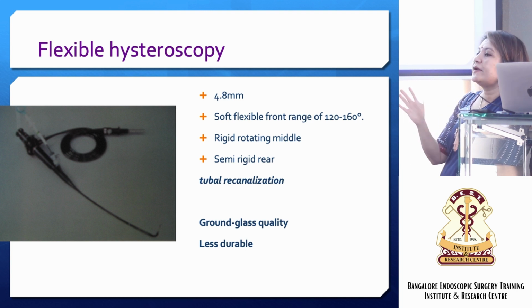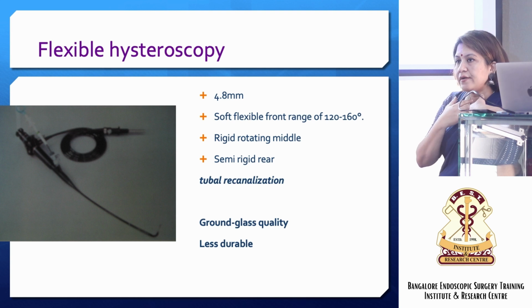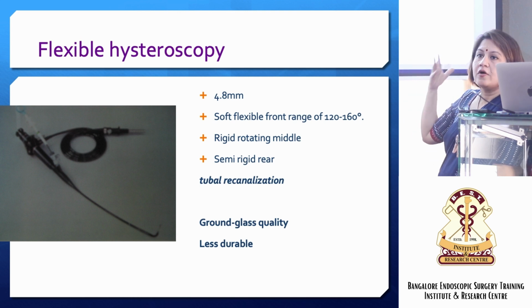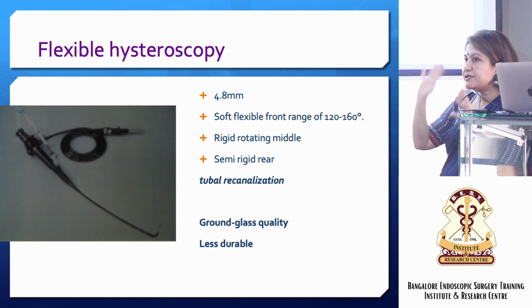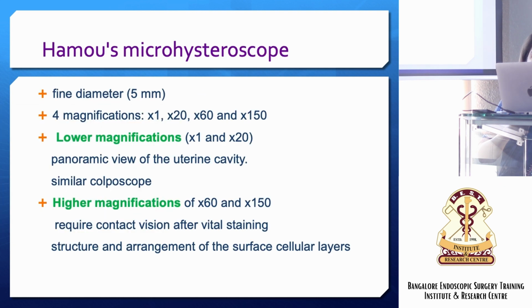It never became popular in our country because the whole setup is quite expensive, and you can just use it as a diagnostic scope for office hysteroscopy, and you can't do much in terms of therapeutic usage. I started talking about this presentation like 25 years ago and it has remained the same. Nothing much has happened in the last 25 years. So this is more like a theoretical thing, that this exists.